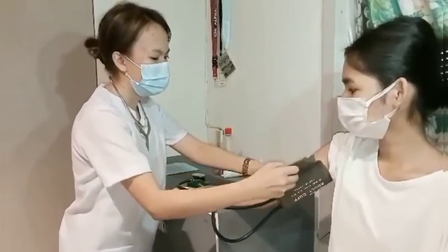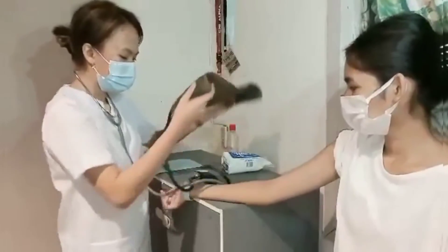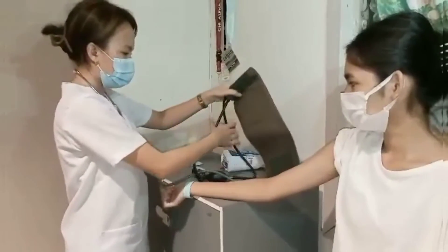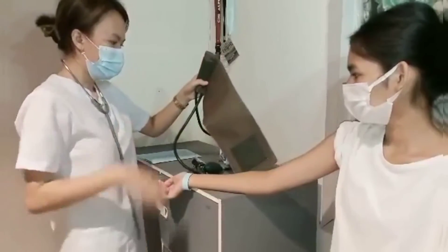After the procedure, don't forget to perform hand hygiene. Lastly, record the readings of each vital sign procedure and indicate the time.